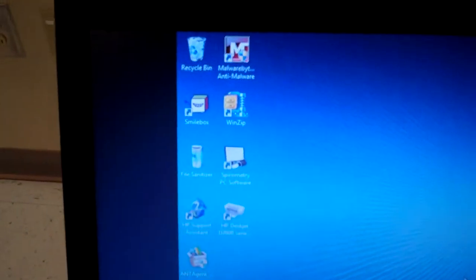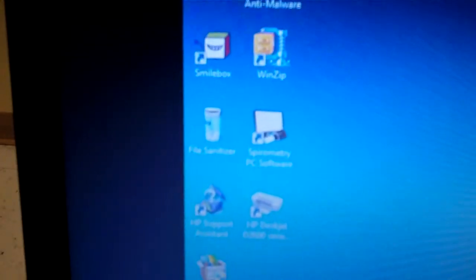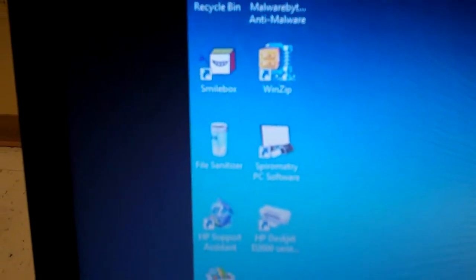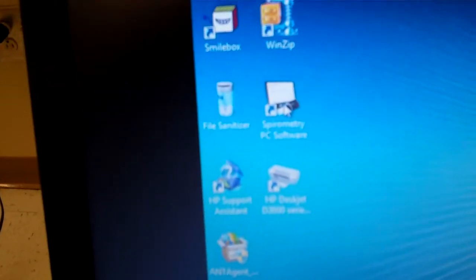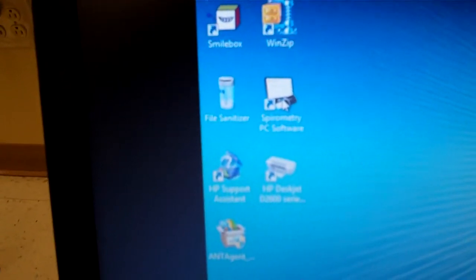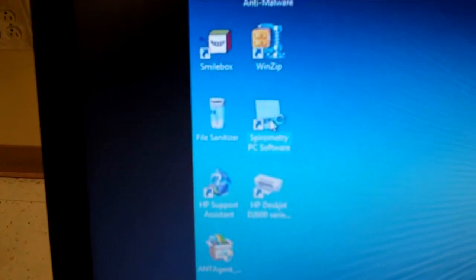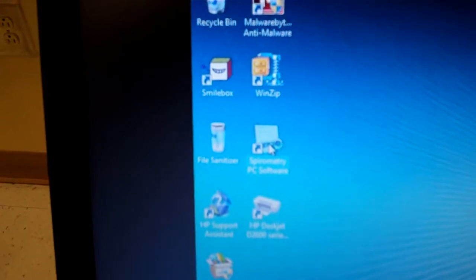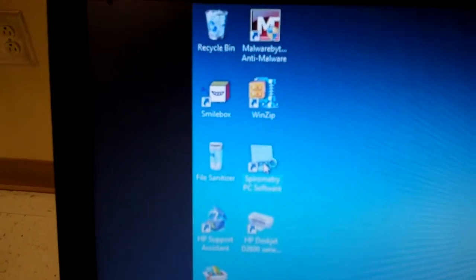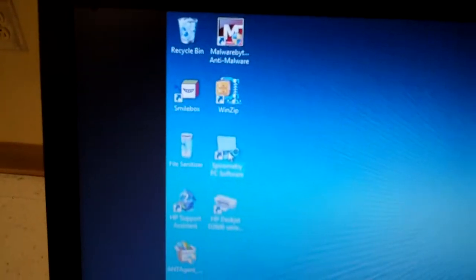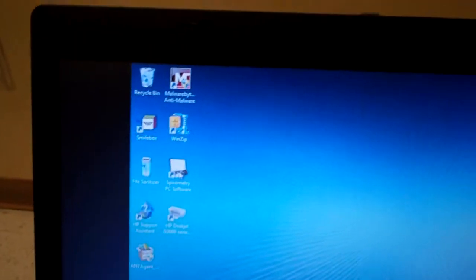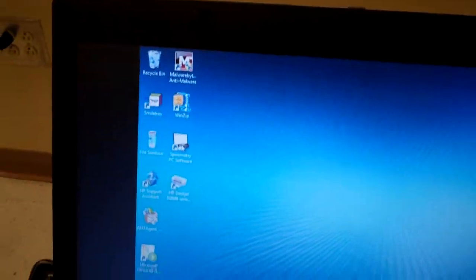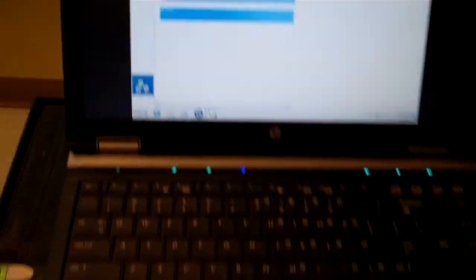The first thing we are going to do is go to the screen, our laptop, open it up, and we will highlight and put our cursor over where it says spirometry PC software. We will double click on that and wait for the program to open up.